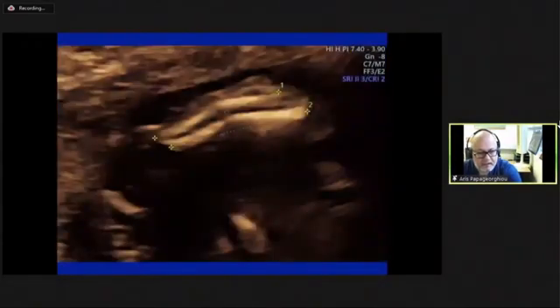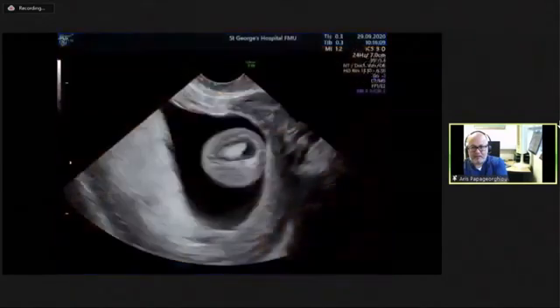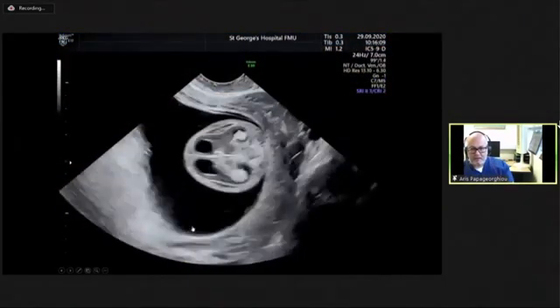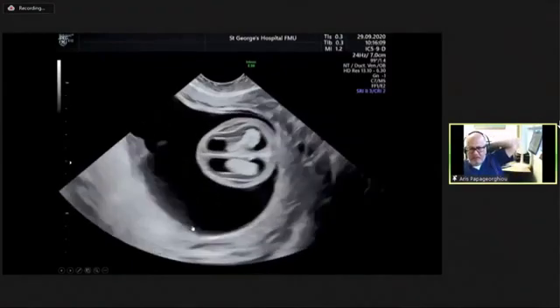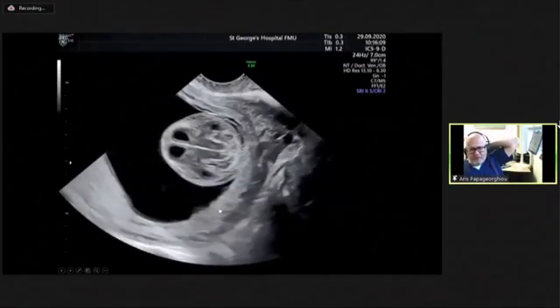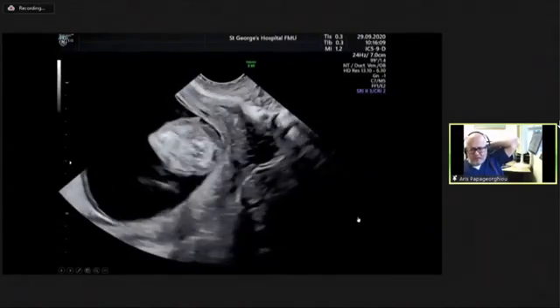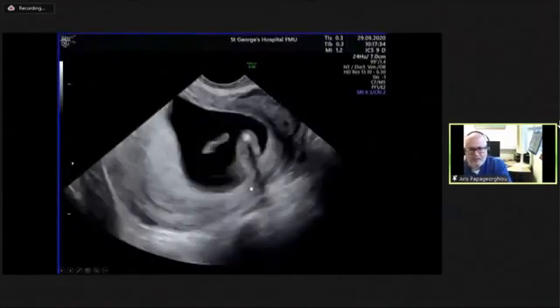Here, then, we continue with some more pictures. I don't know what you think here. You can see these two bones in the forearm. I think I could probably convince you that both of them have a strange angulation and a little break right in the middle. And these are actually cases of osteogenesis imperfecta. Now, when you first do the scan, you sort of put your probe on, and you just get the impression that something's not quite right with the formation of the skull there.